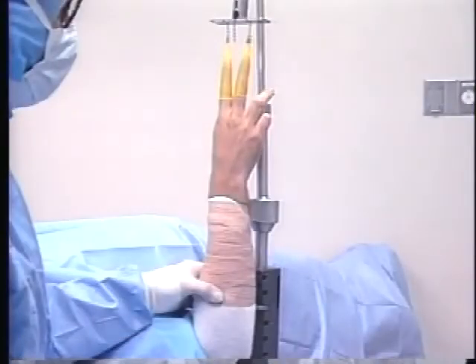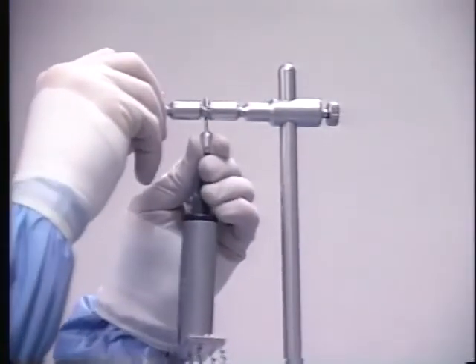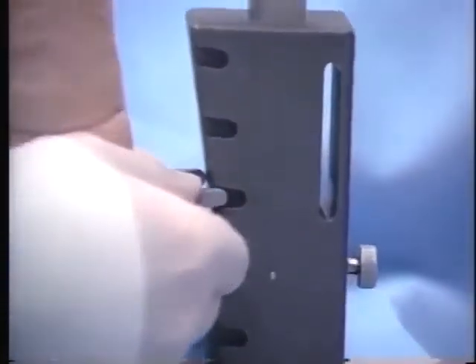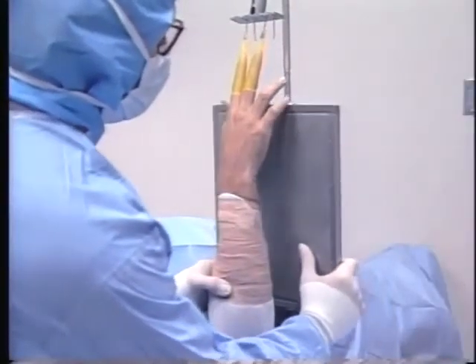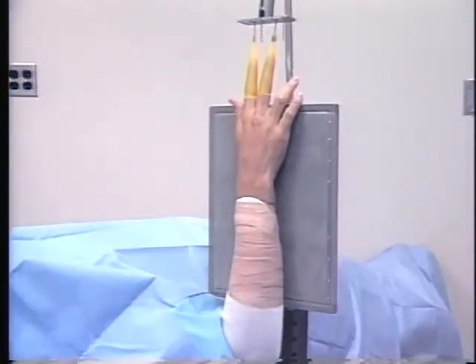The traction tower can be used to create x-rays of surgical repairs using one of two methods: either a standard x-ray cassette or a c-arm x-ray unit. To attach an x-ray cassette to the traction tower, the traction scale is moved to its most proximal location and the x-ray cassette bracket is attached to the most appropriate slot on the primary support. Next, the x-ray cassette is placed on the x-ray bracket and the x-ray is taken.